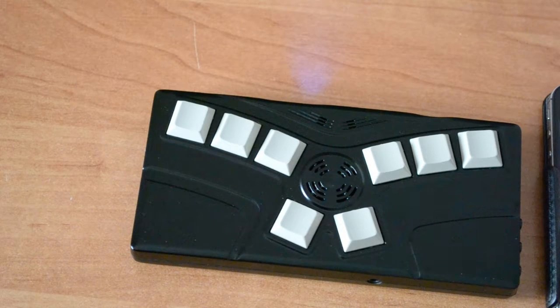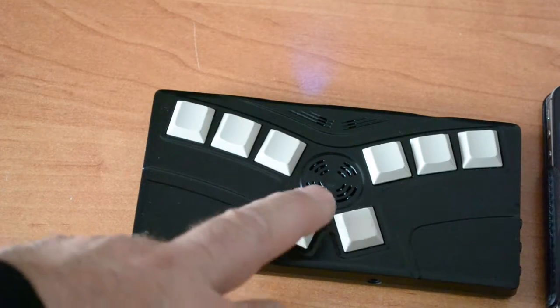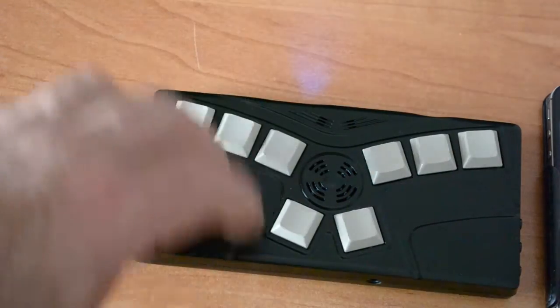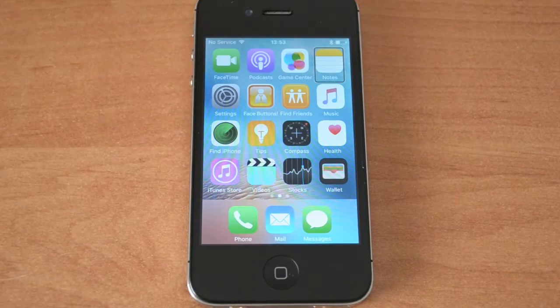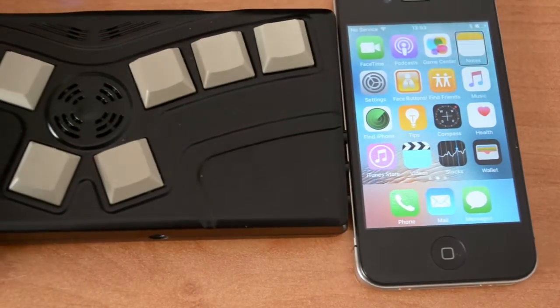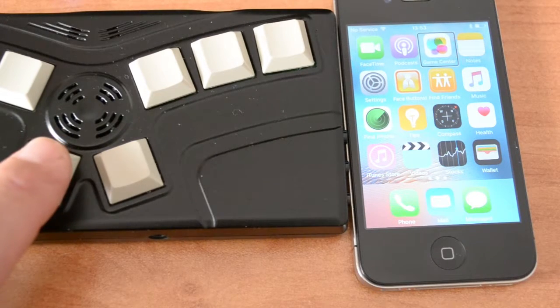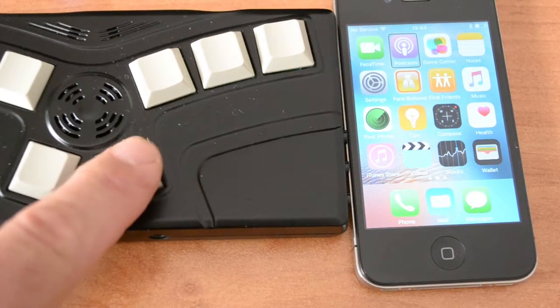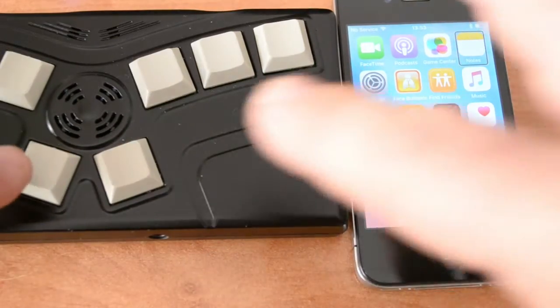Connected as sound and keyboard. And it's already connected. So we have the sound from the IBAI, and we can control the iPhone by just pressing the keys. Game Center. Notes. Double tap to open.